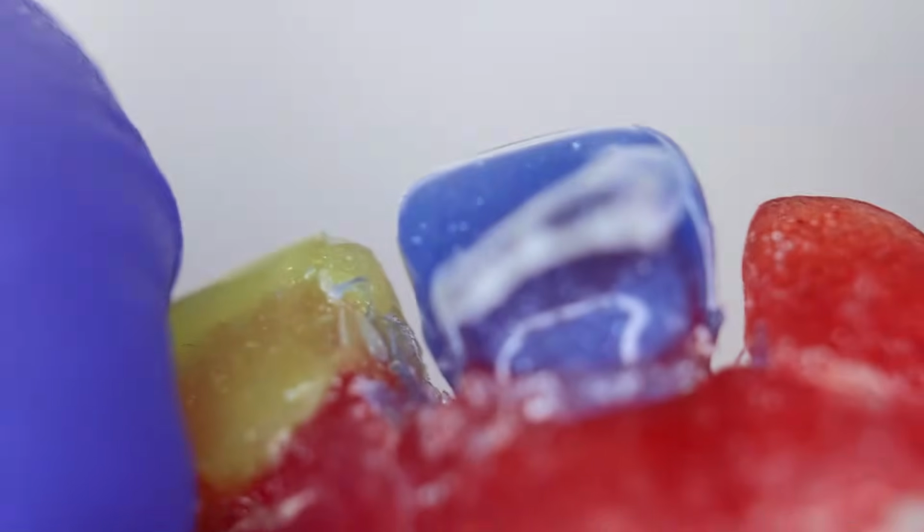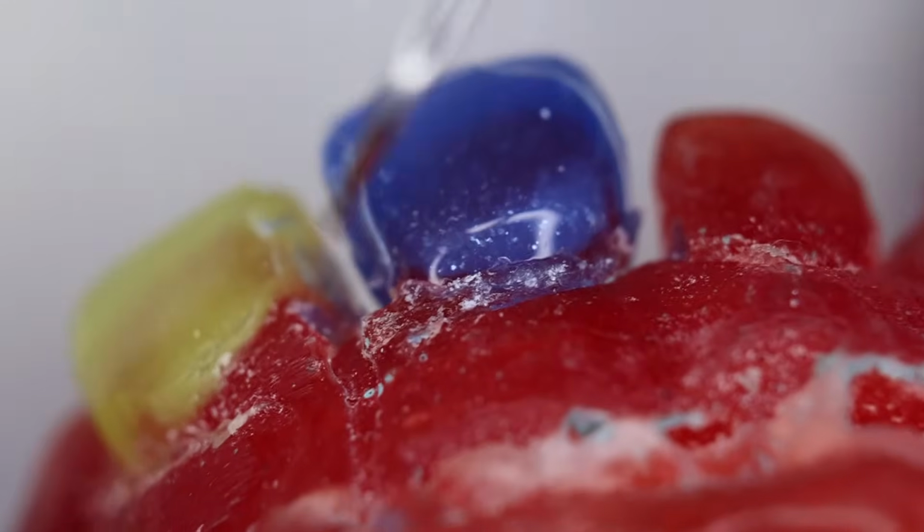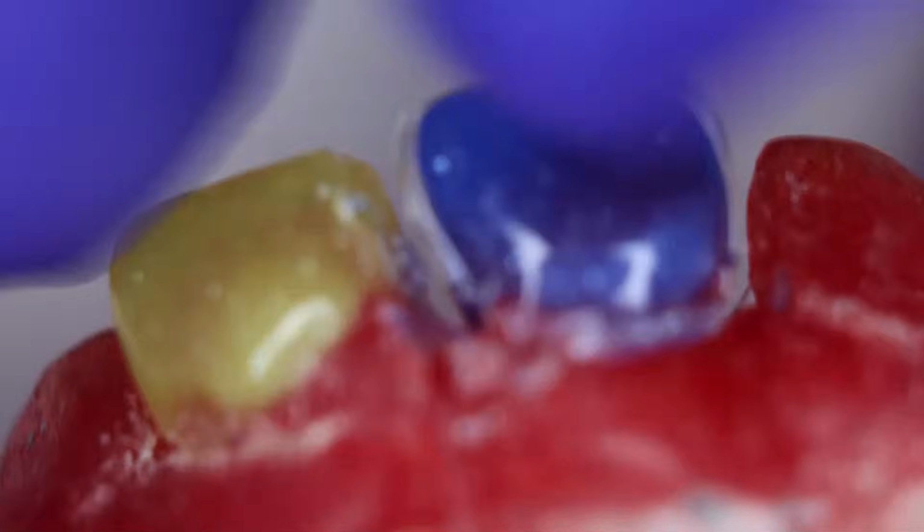Yes, now that part has been cured, so now you can just remove this. Once you get the purchase point, it is then easy to remove.